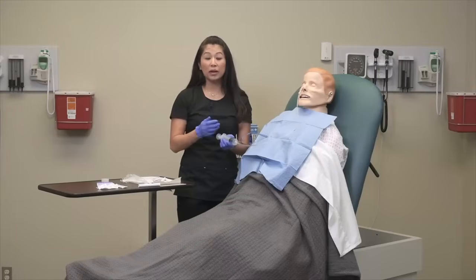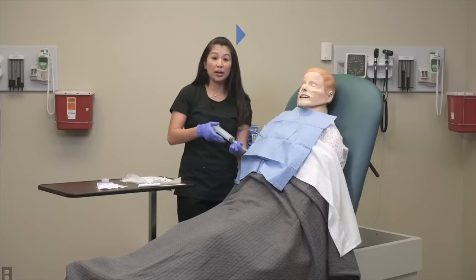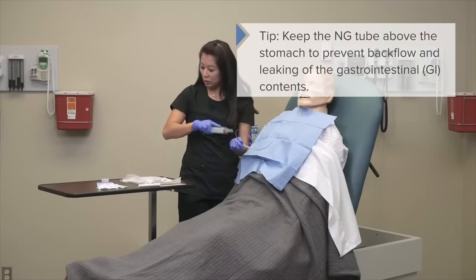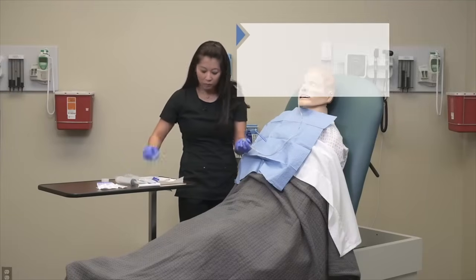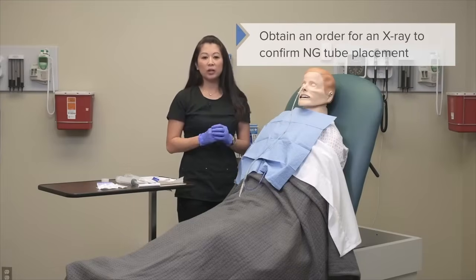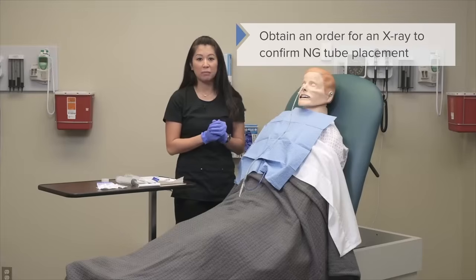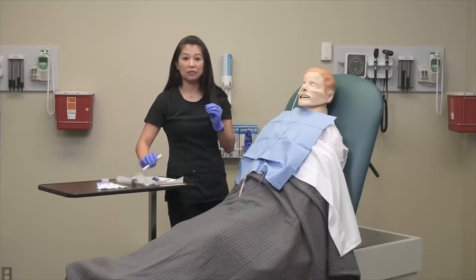Now, one rule of thumb: anytime you remove gastric contents for an NG tube, you want to replace those. That's your patient's normal bacterial flora, and you want to give it back to them. Okay, so that's one way to verify. Then we want to go by our agency protocol and get a chest x-ray and make sure it's in the right place. So one key note I want to talk about while I was advancing.